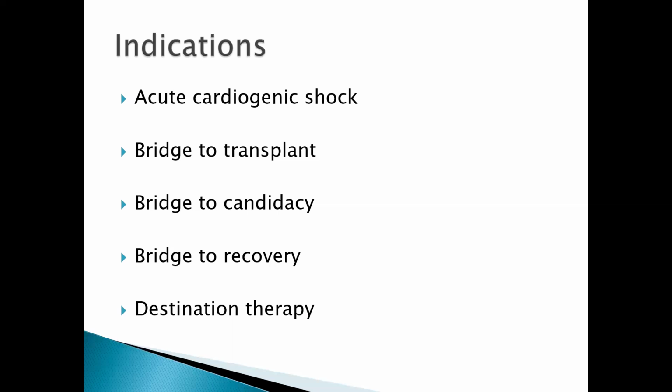And also, bridge to candidacy simply means that this patient has end-stage heart failure but has a contraindication to a heart transplant. But when you place this patient on this device, the patient's status may improve. That is also an indication. So bridge to candidacy means there is end-stage heart failure and the patient is not qualified for heart transplant.